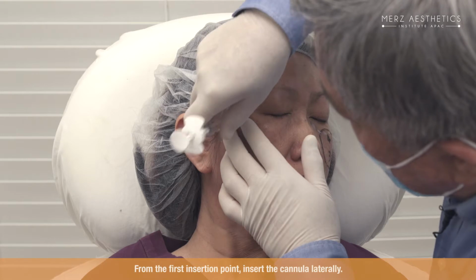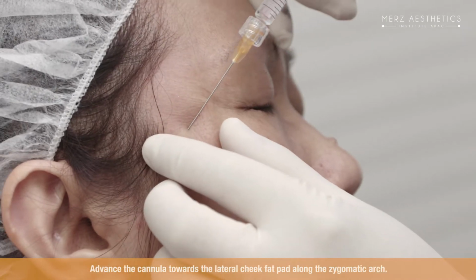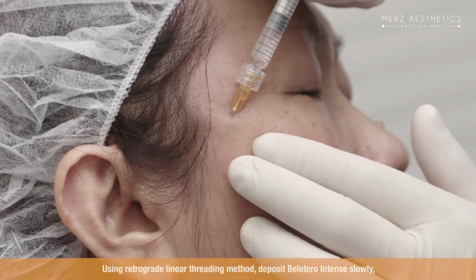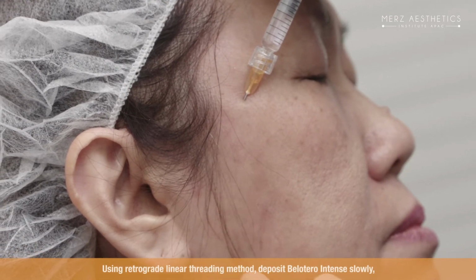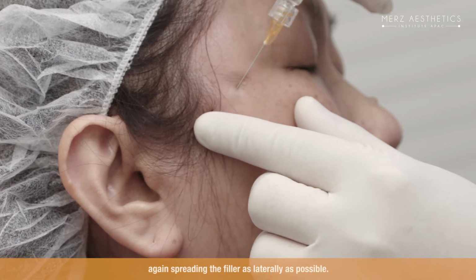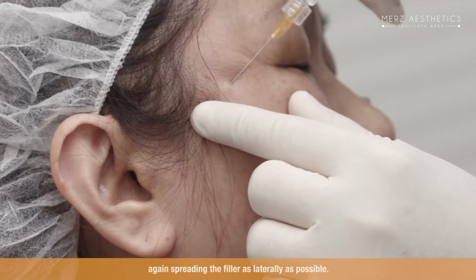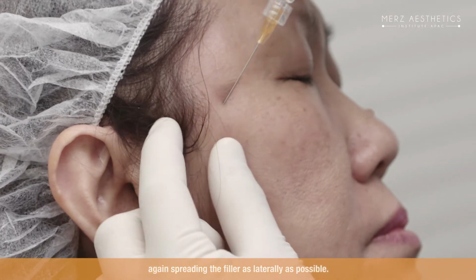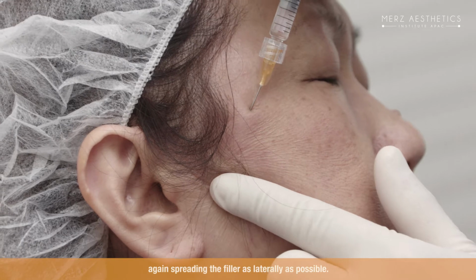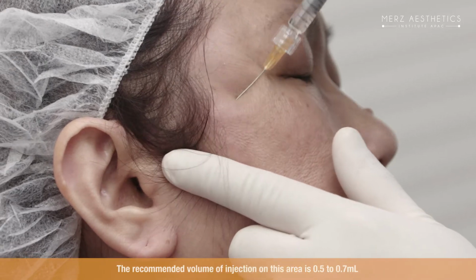The second injection point targets the lateral cheek fat pad. Using the insertion point from the first injection point, direct the cannula laterally and inferiorly, targeting the lateral cheek fat pad. Then deposit Belotero Intense using the retrograde linear threading method, again spreading the filler as laterally as possible. Spread the filler evenly throughout the superficial lateral cheek fat compartment. A significant vector of pull on the jowls will be observed when adequate filler material is delivered and this fat pad tenses up. The recommended volume of injection in this area is 0.5 to 0.7 milliliter.